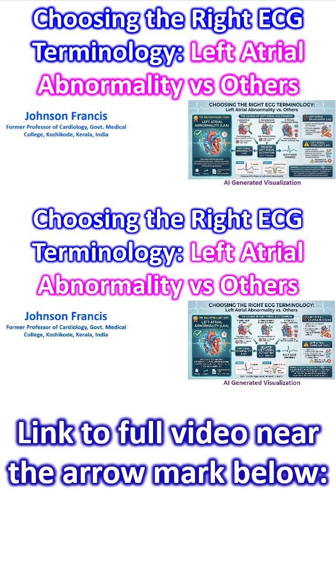Choosing the right ECG terminology: left atrial abnormality versus others. The same discussion applies to right atrial abnormality as well. Left atrial abnormality is the most accurate and guideline-preferred terminology.